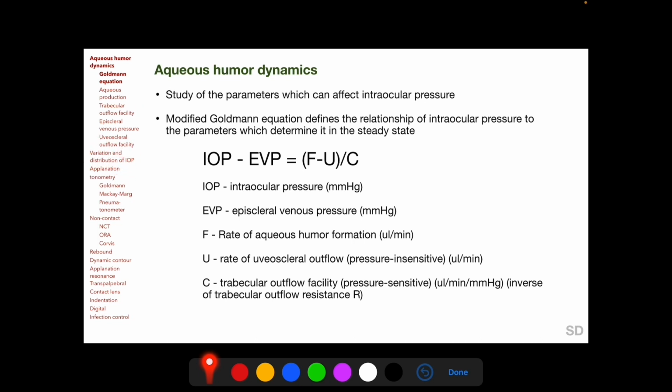and there are also a large number of techniques to measure intraocular pressure. We'll be discussing Goldmann applanation tonometry in detail, but for the remaining techniques of measuring intraocular pressure, we'll be discussing their underlying principles with simplified diagrams and their pros and cons in specific clinical scenarios.